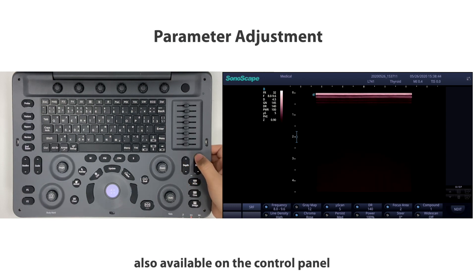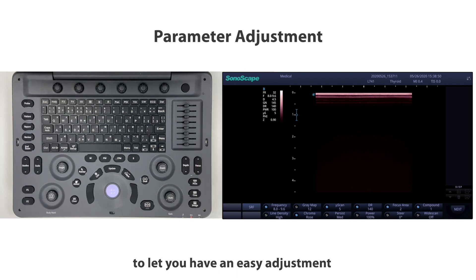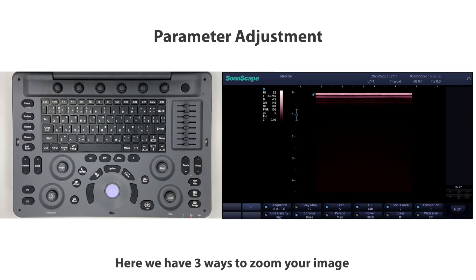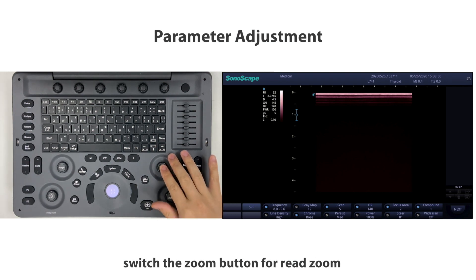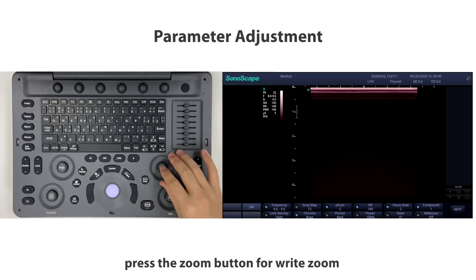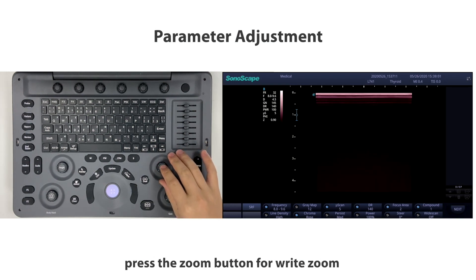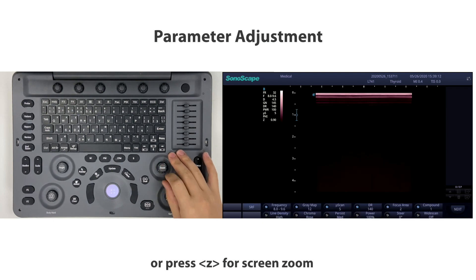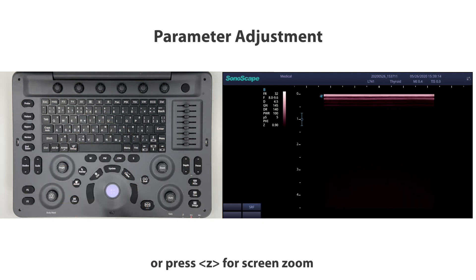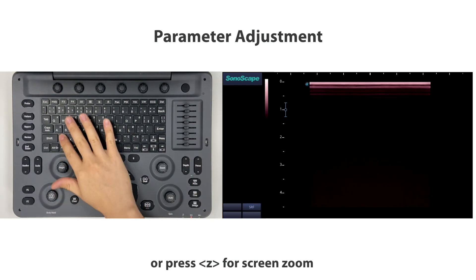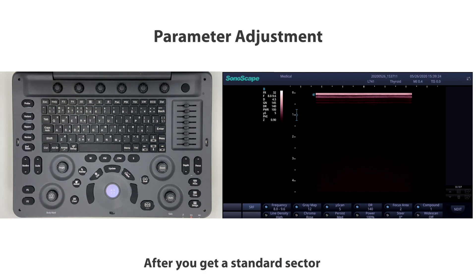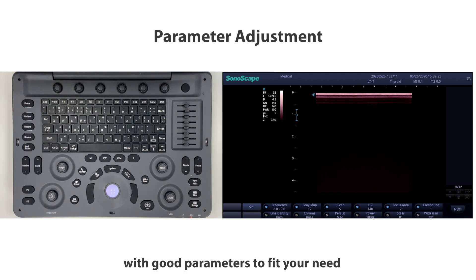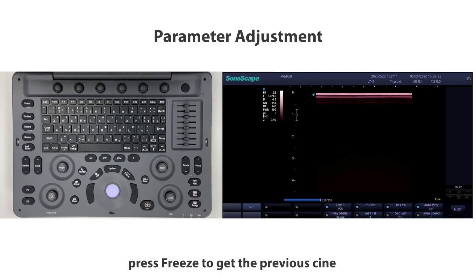Other frequently used parameter buttons such as depth, focus, and zoom are also available on the control panel for easy adjustment. There are three ways to zoom your image: switch the zoom button for read zoom, press the zoom button for write zoom, or press Z for screen zoom.